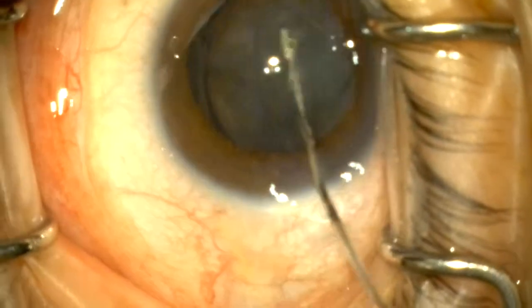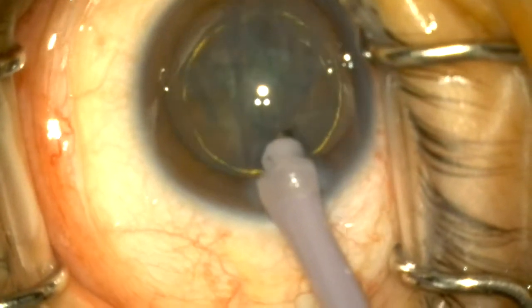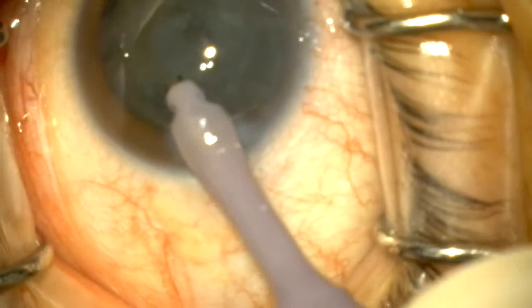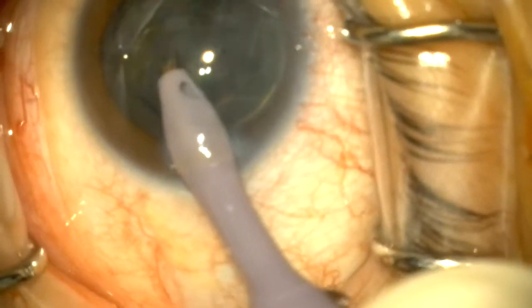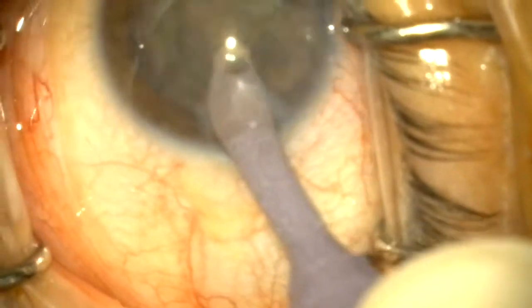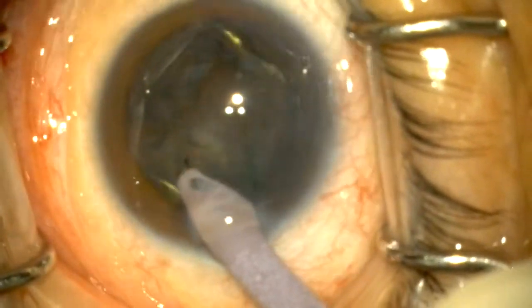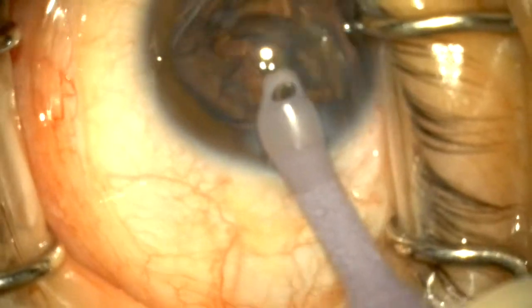This was seemingly an uneventful case. In the beginning of the surgery, I did a hydrodissection and hydrodelineation and removed the lens without any problem. In an immature cataract, it is easier if hydrodelineation is done to pop the lens up so that phacoemulsification can be done easily. All that is needed is just to maintain the phaco probe in the middle and gently phaco the remaining nuclear material away.